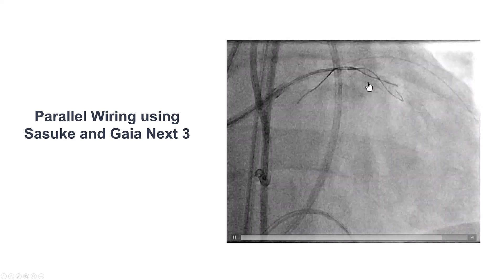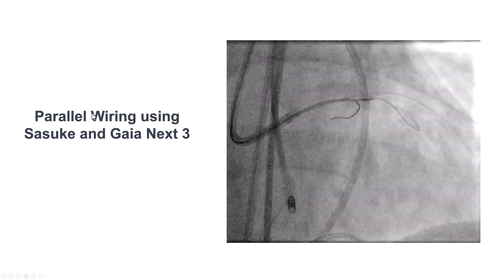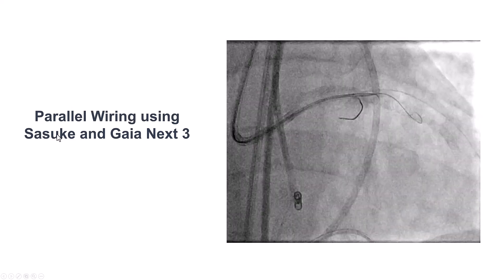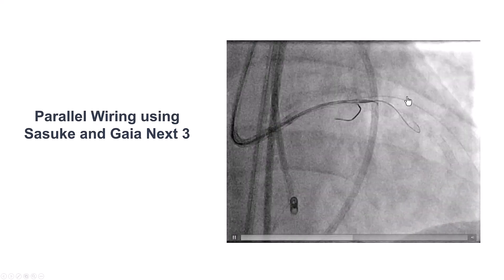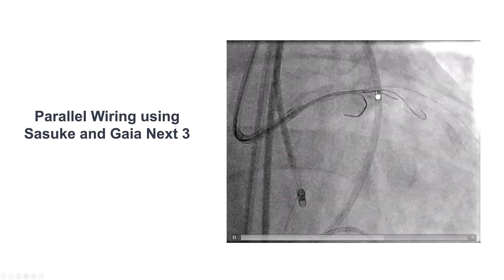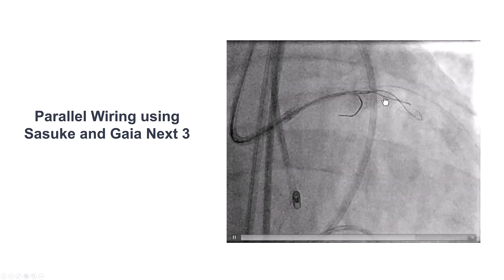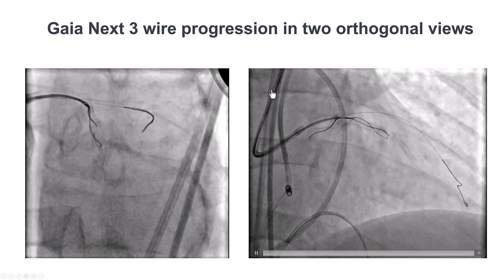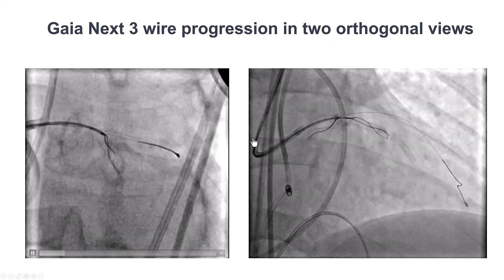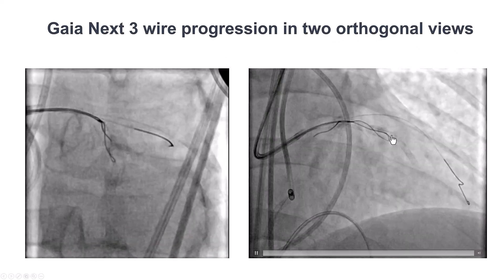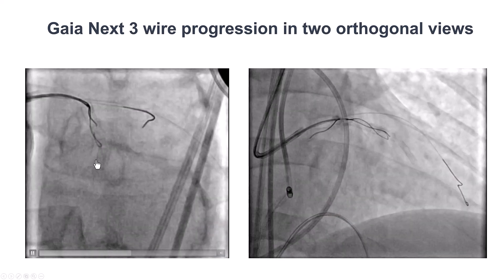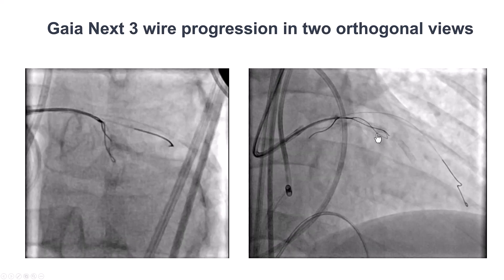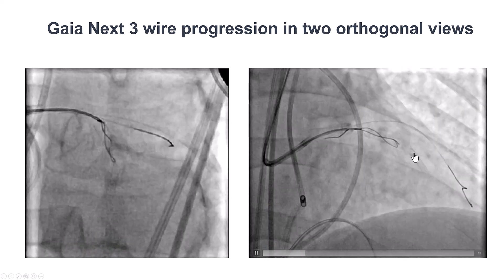The other option is to leave the existing wire in place and then try parallel wiring, which can be facilitated by using a dual-lumen microcatheter. So we brought in a Sasuke and a Gaia-NX3 and tried to navigate, and we can see that the wire is actually moving in a different course that seems to be more inside the stent. We did use different projections to confirm that the wire was moving inside the stent — both RAO and LAO cranial views — and we can see that the Gaia-NX3 is moving in the right direction.